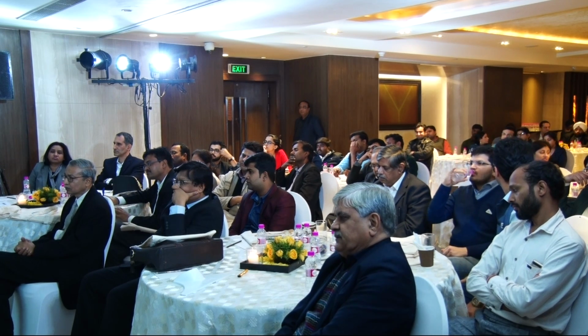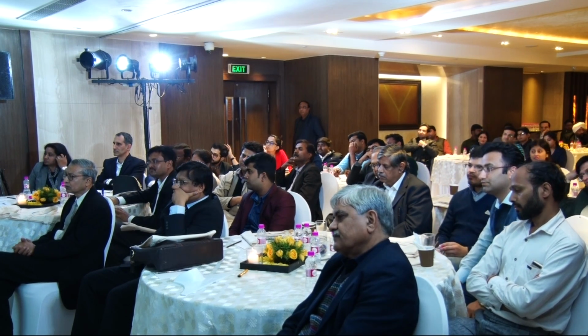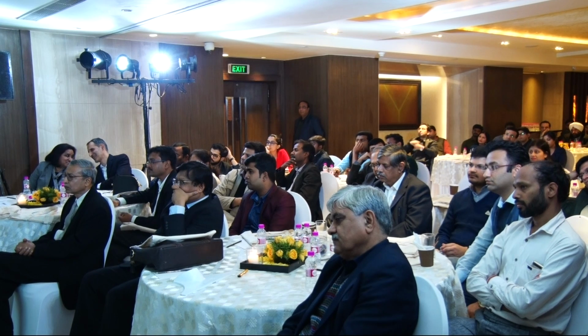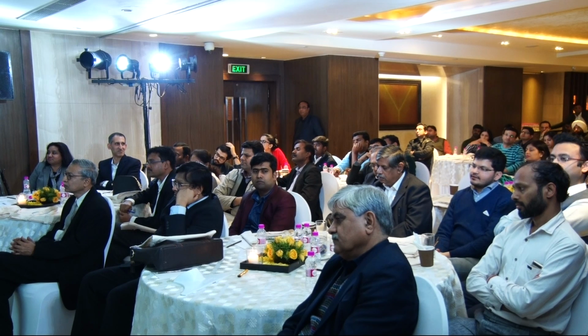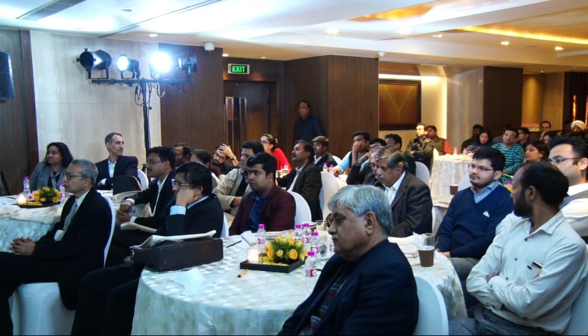that the lung patient is in a very good posture. The curvature of the T-spine, the C-spine, everything is lining up. We've corrected that posture ahead of time with AlignRT, and we're now looking at internal anatomy fit. And so we do a quick registration on our cone beam CT. Moving to the next slide, on slide 22, that now allows us to do something unique with SGRT.